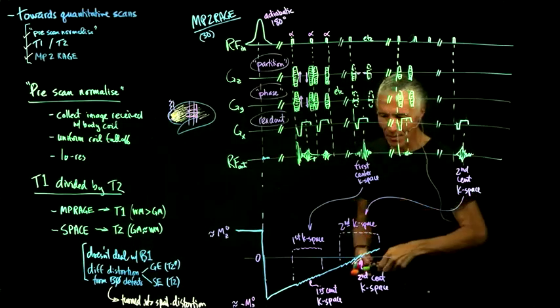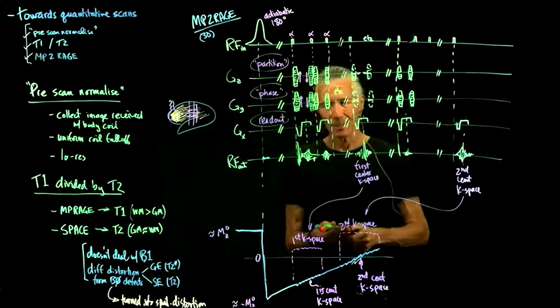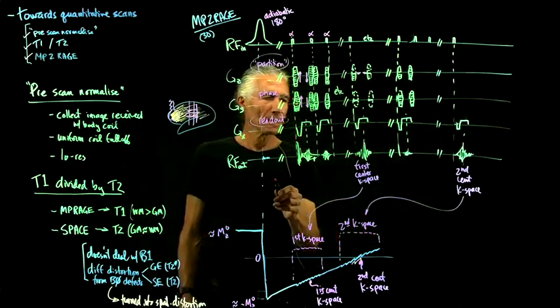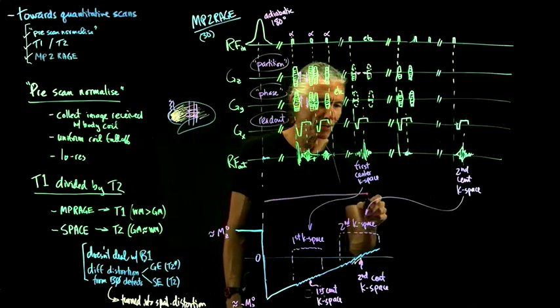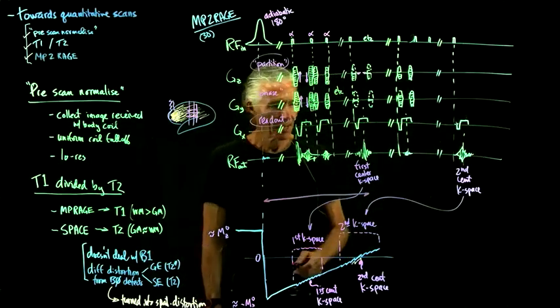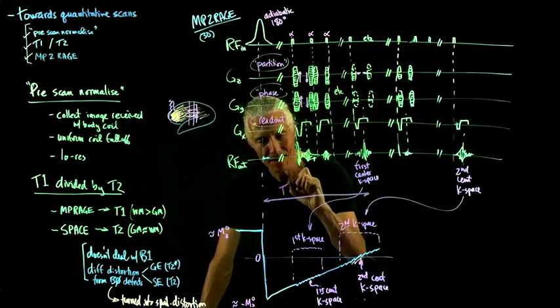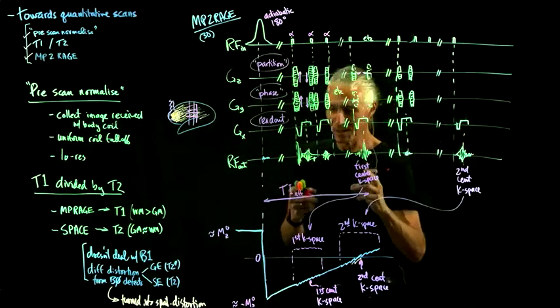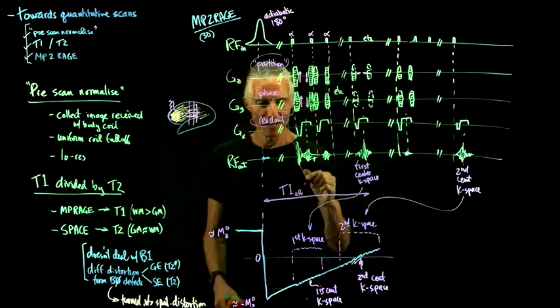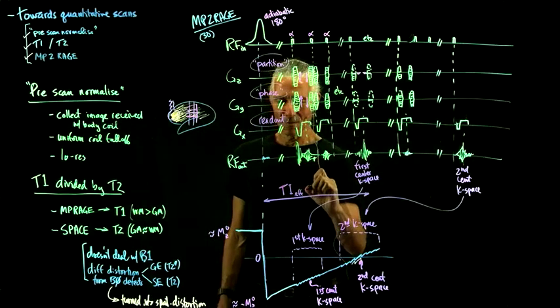So basically now we just have two complete k-spaces, with two different inversion times. There's going to be one inversion time here, TI effective, because remember, all of these have different inversions, but just the center of k-space inversion is TI effective 1.